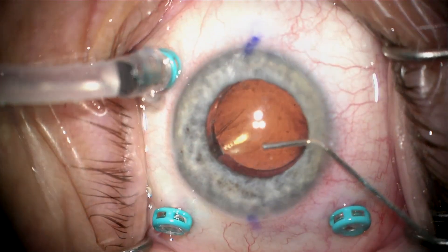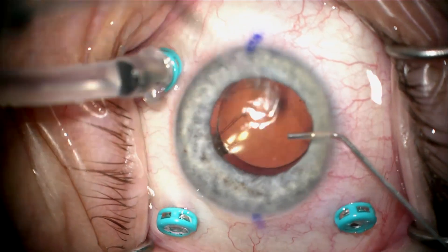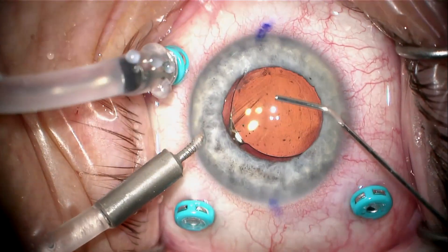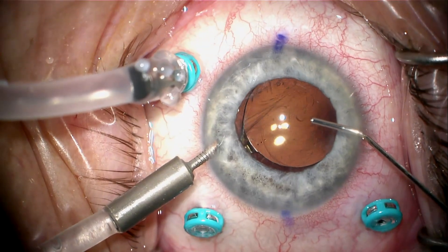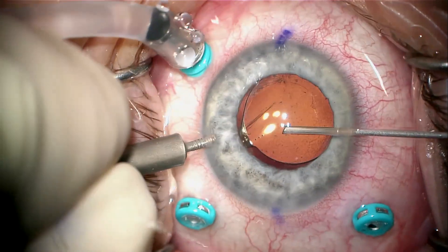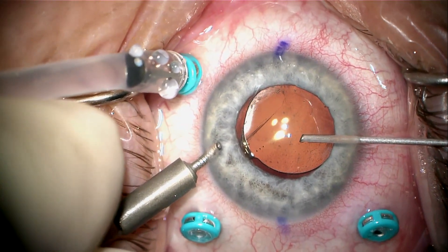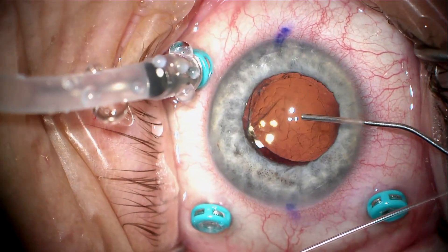We're injecting Miochol to bring the pupil down, and also to clear these inflammatory precipitates from the corneal endothelium using a jet stream as we inject. You can see we're able to blast those keratic precipitates off the endothelium and remove them with the vitrector.